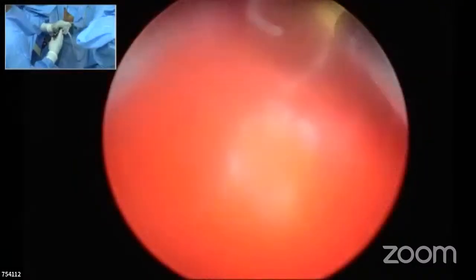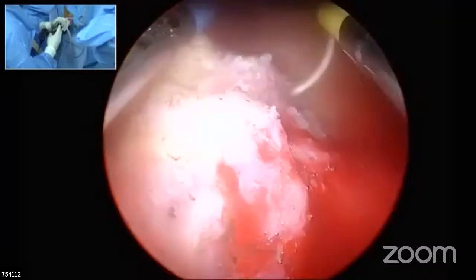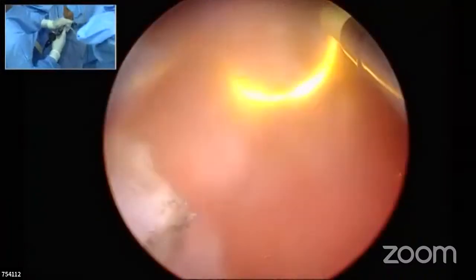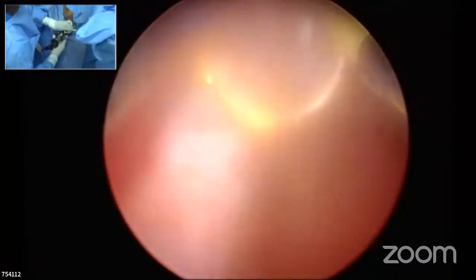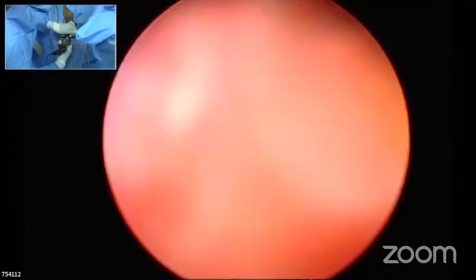I have some tissue still, which I'm resecting. Again, I'm talking about the half loop. Use a half loop. Never try to use the loop completely. Half to resect, half to cut, and half to assess the depth. So that gives you a better knowledge of how much to resect.